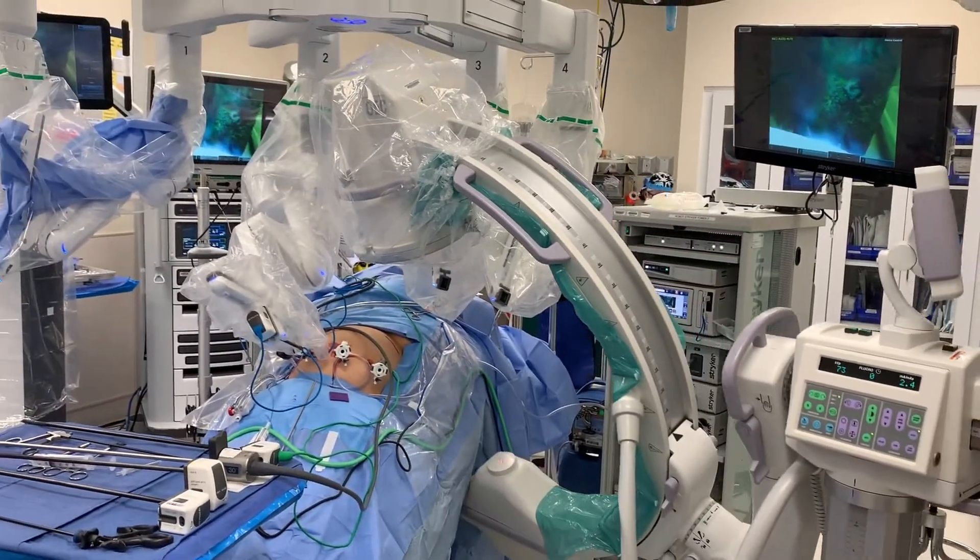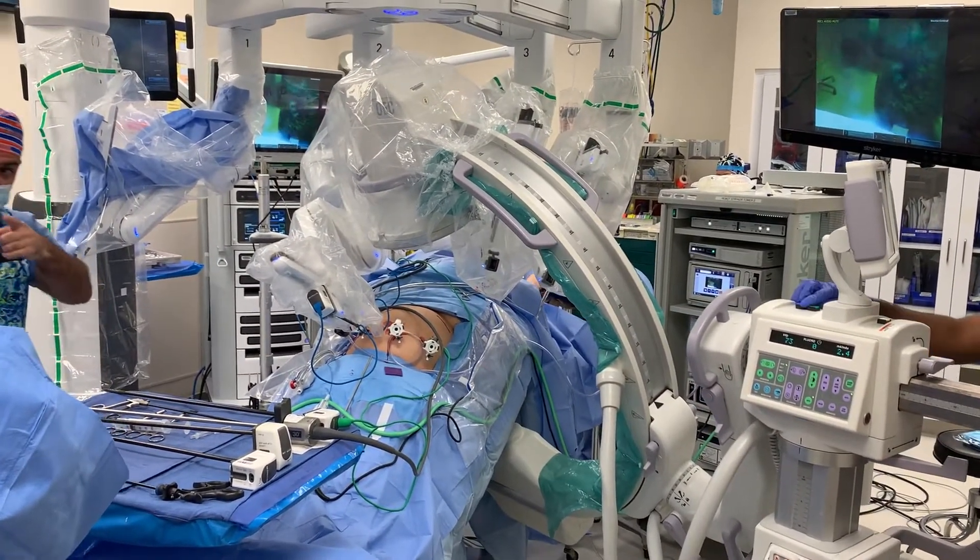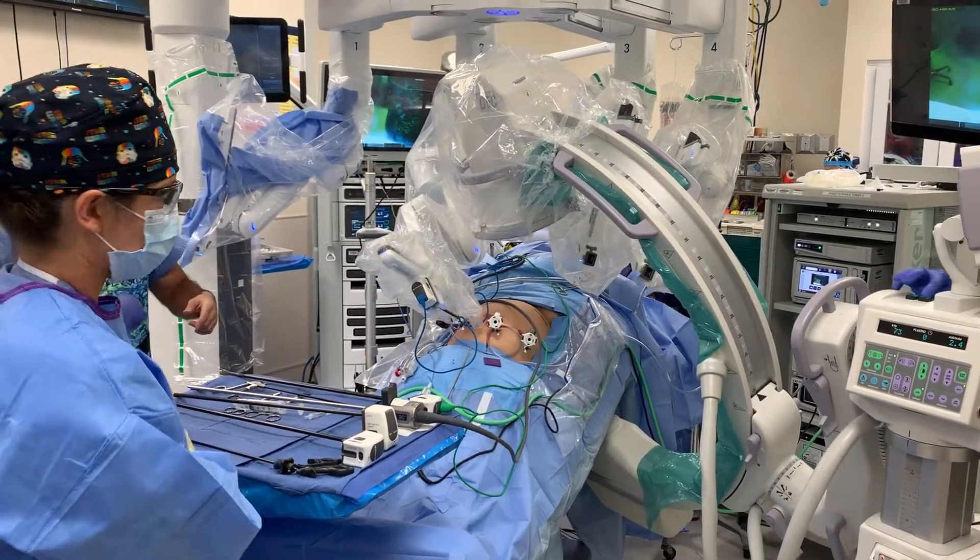The total time for this fluoroscopy was about 2 minutes and 30 seconds. It is fairly straightforward and does not take long.